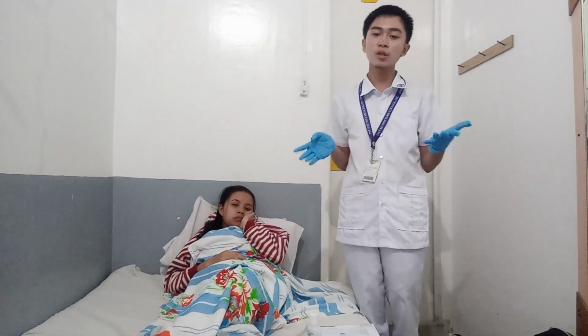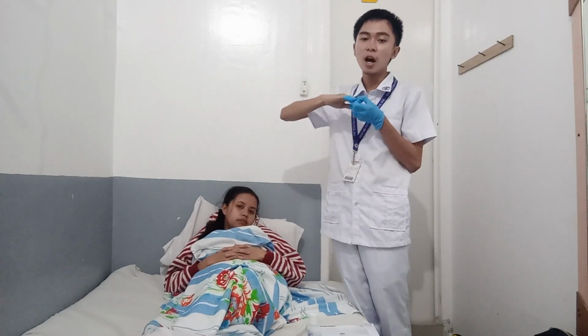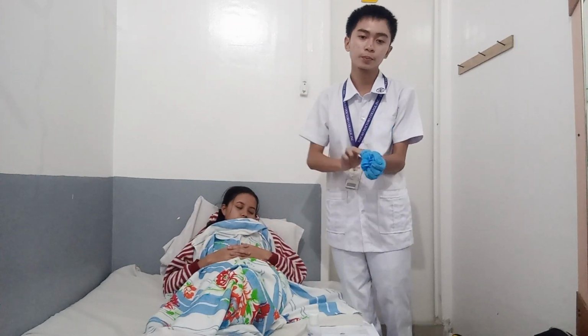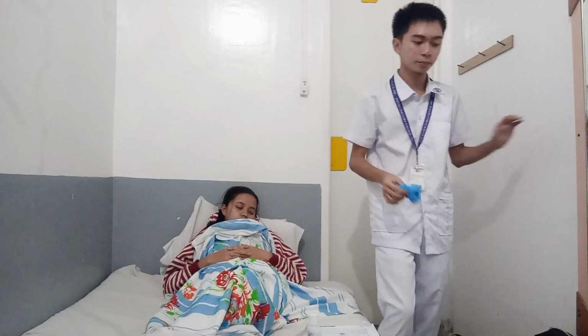Okay? Now do aftercare: remove the gloves and dispose of used items in the appropriate waste receptacles. Return other equipment to the proper place, especially to the MAR machine. After doing the procedure, discard the gloves, use the appropriate waste receptacles, and perform aftercare of the equipment, returning it to its proper place. Perform hand hygiene.